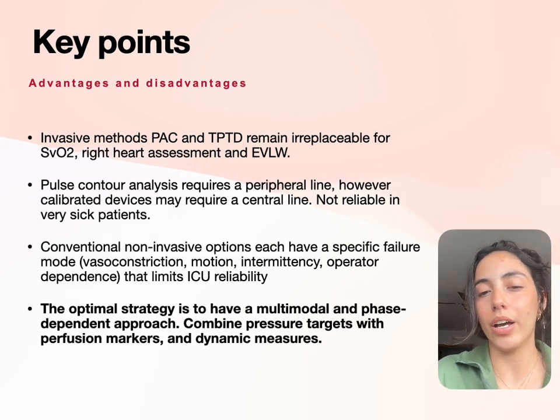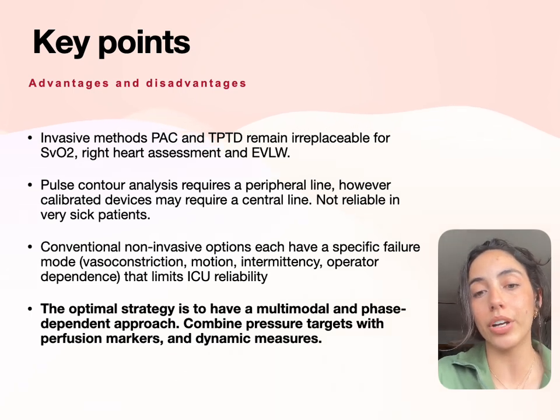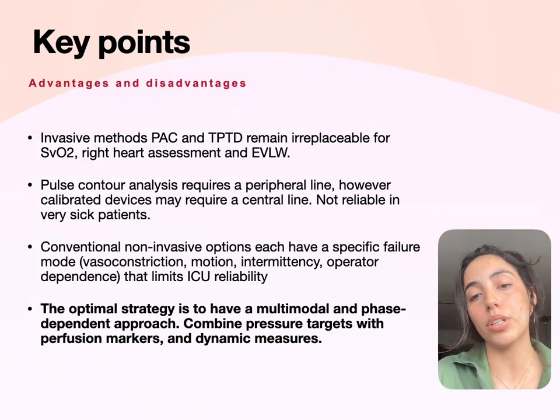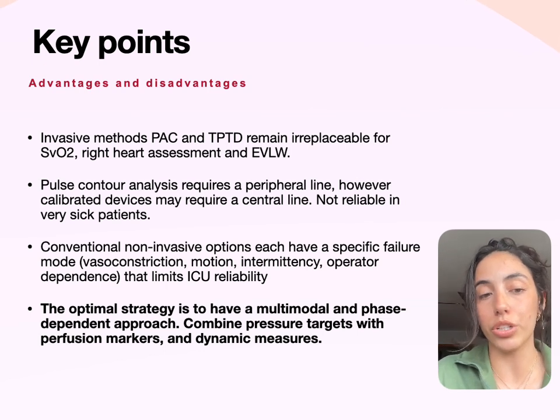This is why invasive and non-invasive techniques, the minimally invasive ones that need to be calibrated, uncalibrated, we really have to understand what the advantages and limitations are of each one of these so that we can integrate them and make sure that we provide the best patient care possible. Therefore, as we can see in bold, the optimal strategy is to approach this through a multimodal approach and also a phase-dependent approach. It's also going to depend on the hemodynamic status of a patient in that moment, the type of monitoring that we are going to resort to.